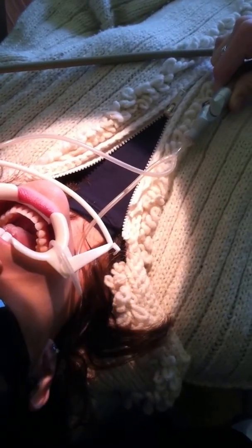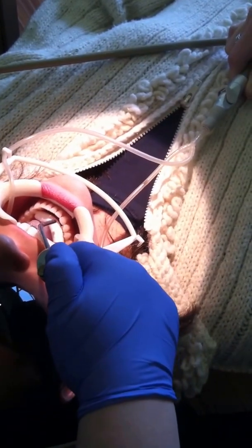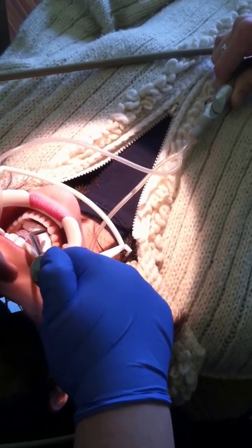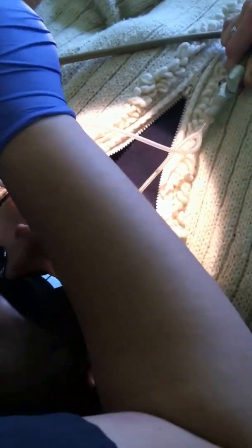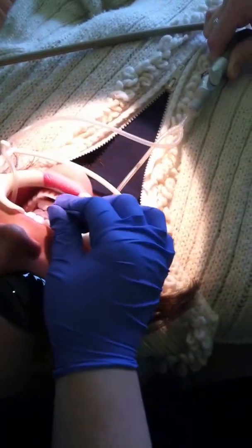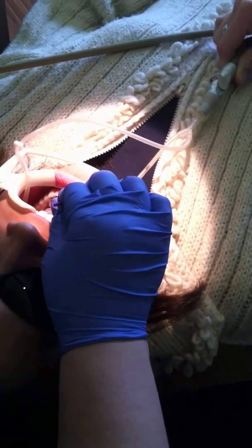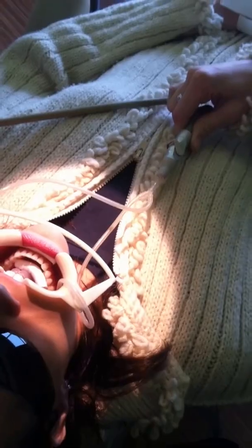You can do all of this with direct vision, or if you prefer to use a mirror, you can place a mirror and see your chalky surface. From here on we're going to use the Transbond primer etch — a pretty straightforward orthodontic bonding procedure. Place the etch and thin it dry.